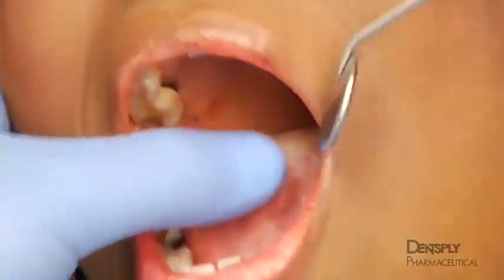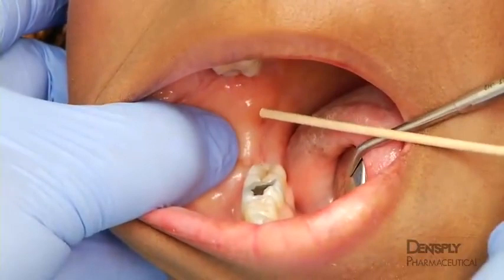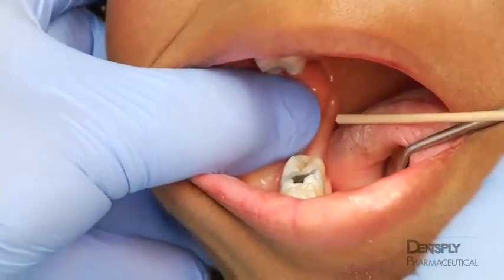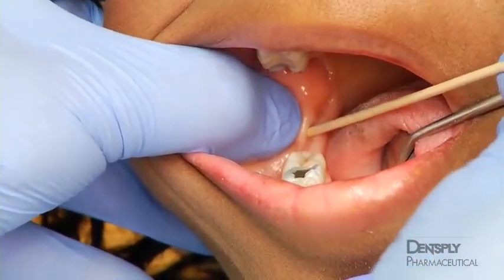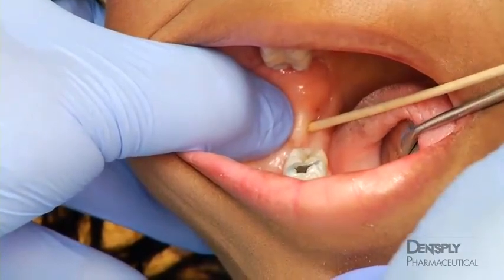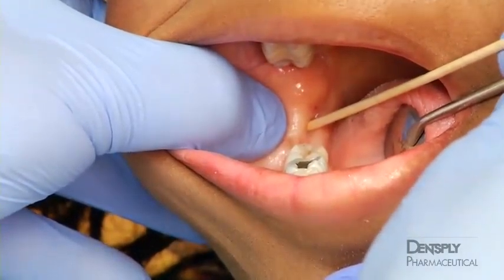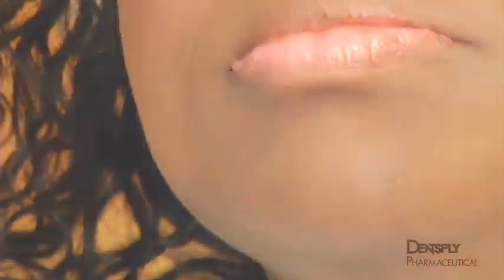Perhaps the most common cause for failure of the standard inferior alveolar nerve block is positioning the needle tip too far inferiorly. This can happen if the coronoid notch is not palpated correctly, for instance, if the thumb is too medial and palpates the temporal crest. Even if the notch is correctly identified, bisecting the thumbnail will misidentify the insertion point if the thumb is not parallel to the mandibular occlusal plane. These errors are more likely to occur in the patient who is missing posterior teeth.